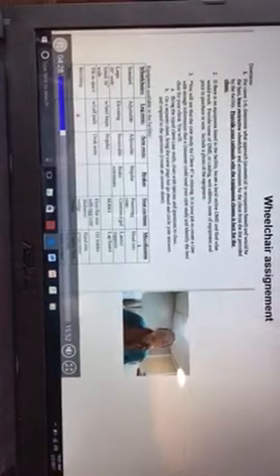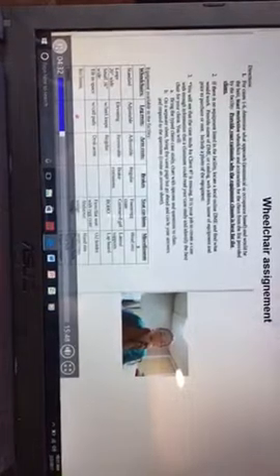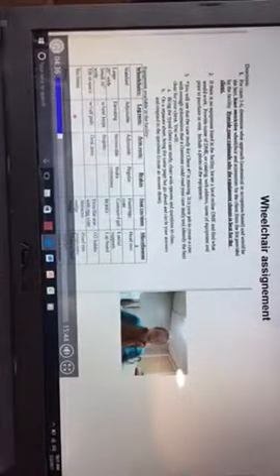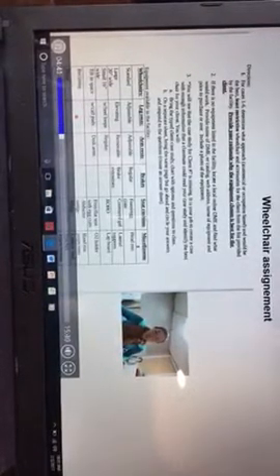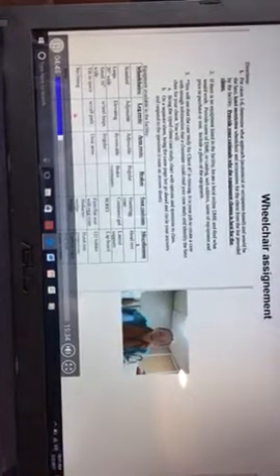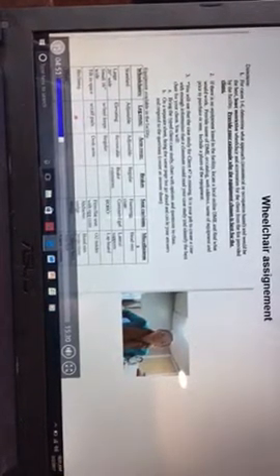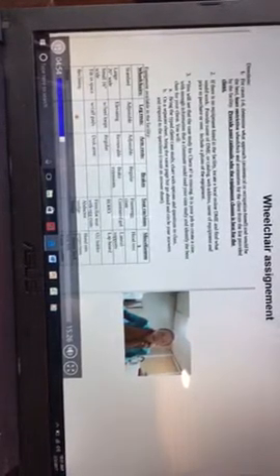Armrests, a couple things to keep in mind. So the regular armrests, they're great because I have lots of real estate to push off of, because they come up far enough that if I have issues with bringing my arms all the way back to push up and I need more ability to push up beside myself, then it's good to have regular length arms.